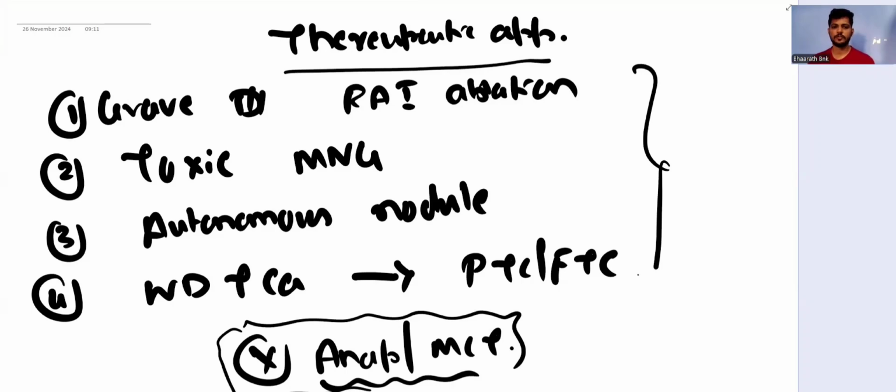Therapeutic application of radioiodine is again an entirely different topic. This is the class about radionuclide imaging. So we'll have a separate class for these therapeutic applications of iodine. Now we'll see what happens in a parathyroid.